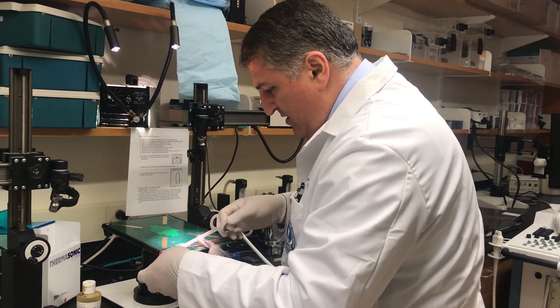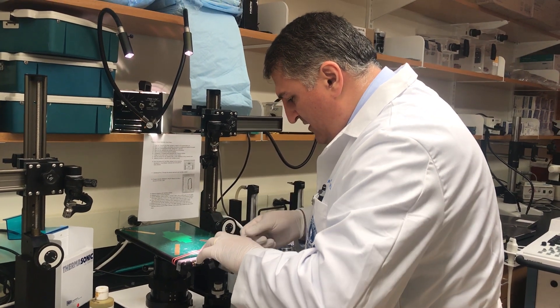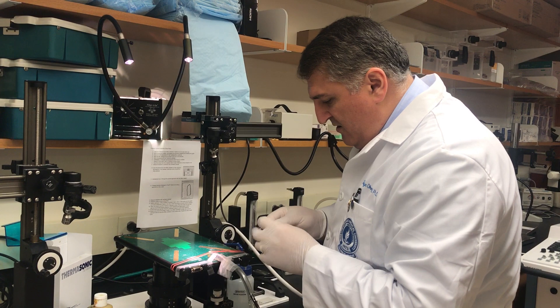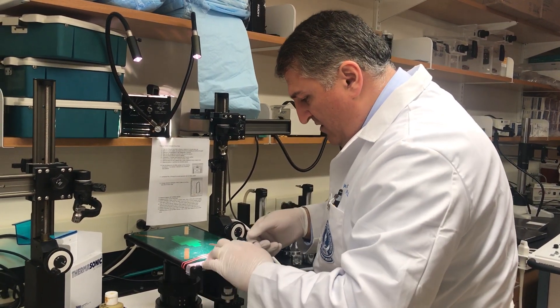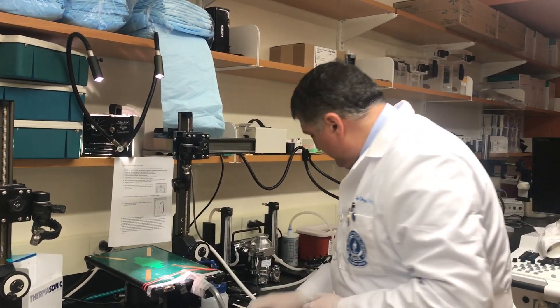Station now, I am preparing for intubation. I recommend the nose cone for beginners who don't have good experience intubating the animal, as it will give them a longer period of time for intubation.